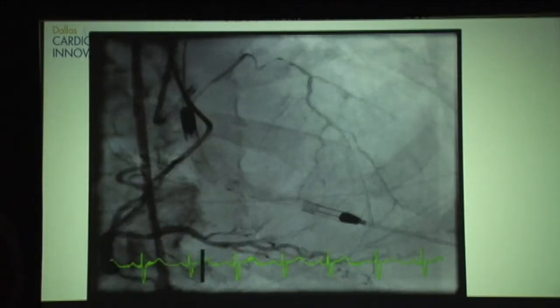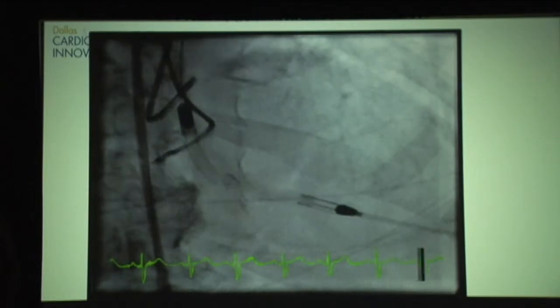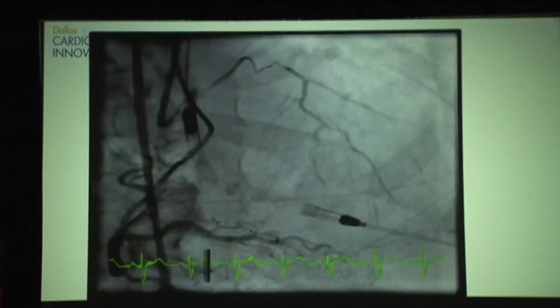We put the Impella in from one groin, the left groin. We used the right groin for what will ultimately be our left main guide, which is an EBU guide, a 7 French. And then we used right radial access for a guide for the right coronary artery, mostly just to visualize the left, but we were also prepared to go retrograde if that's what we needed to do.